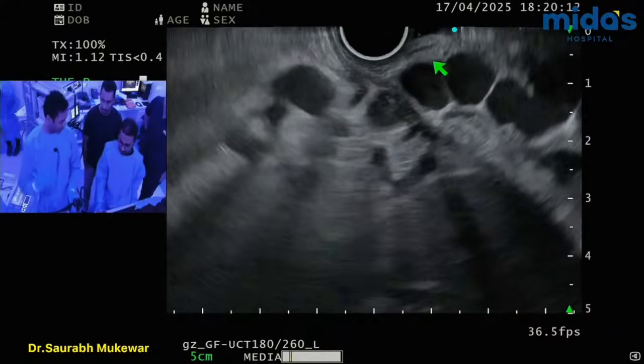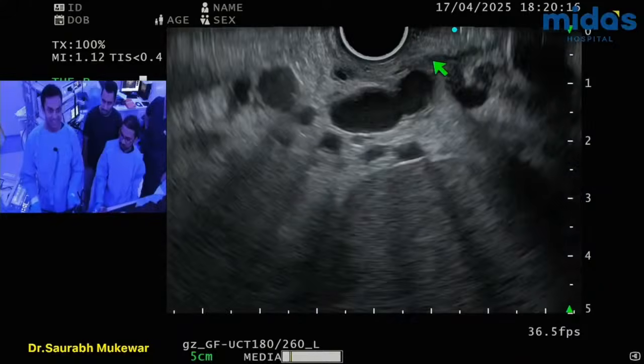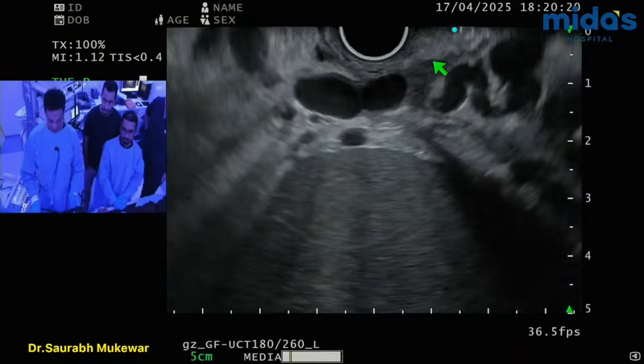That's what happens when you're absolutely ready to put the needle in and something goes off. Yeah, so here's what I'm going to do. I'm going to go microscope.